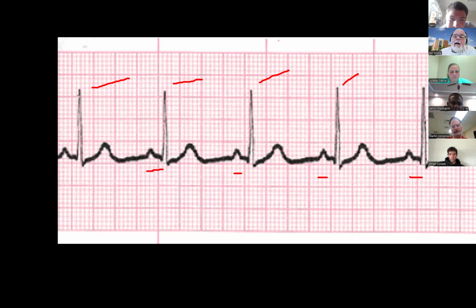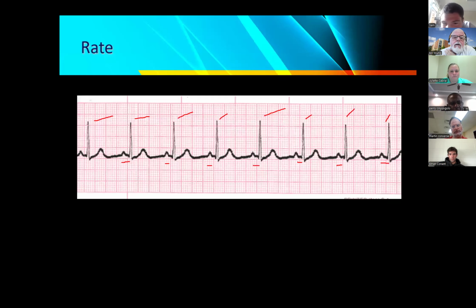Okay. Now, I would say it's probably more closer. Let me get out of there. So we've got one box there, two boxes there. So I always say it's closer to either 3.5 or 4. But again, that's just me. So you say 3 boxes. I'm okay with that. Is that within a normal width? Yes. Perfect. All right. One last thing we're going to measure here, Sam.